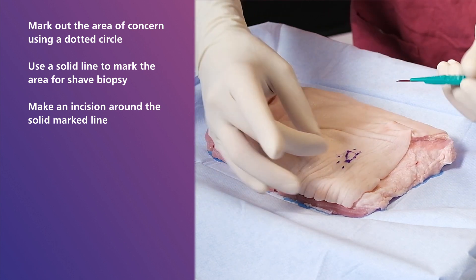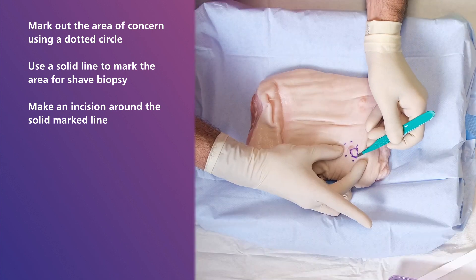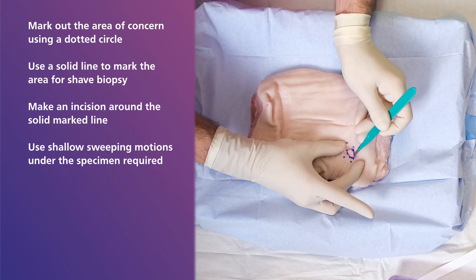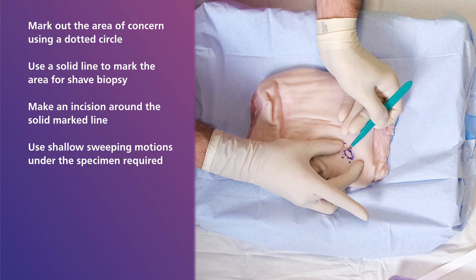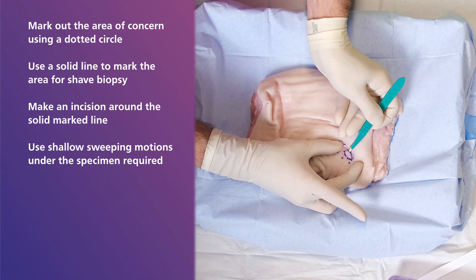Next, still using the scalpel but this time using it horizontal and more parallel to the skin, use shallow sweeping motions under the specimen required. This performs the shave biopsy. By using this horizontal technique, it allows the depth of the incision to be controlled and allows for a more superficial sample to be taken.